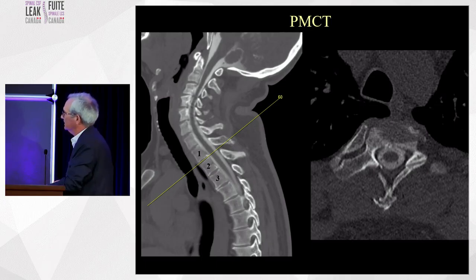We always do a CT scan after the digital subtraction myelograms. We always do them within about 20 minutes. And this is not dynamic. This is just the patient staying in prone position going to CT. And you can see at the T1-2 level, we have a spur or a small spicule that's very commonly associated with a ventral type of leak, a type 1 leak.